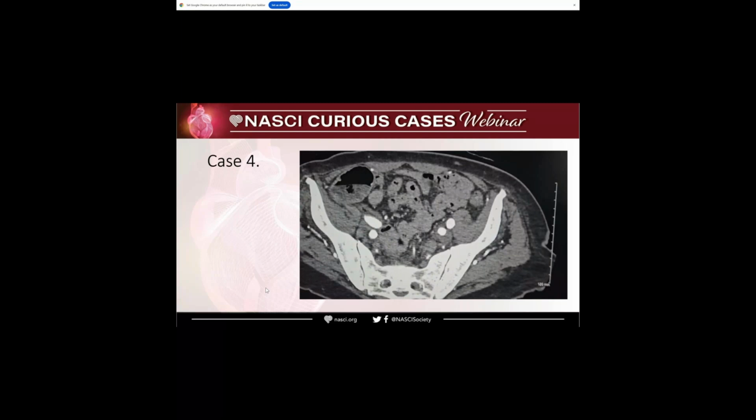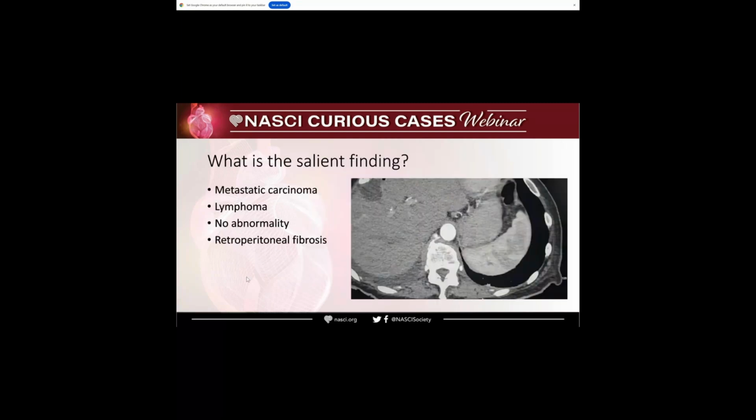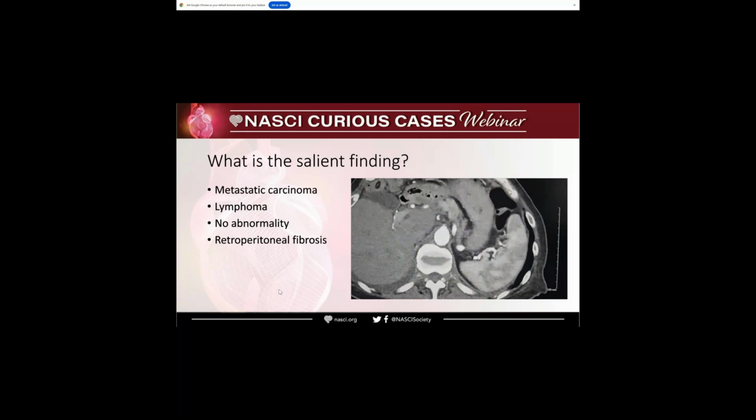What is the salient finding? I'm showing the video again so you can see it while you see the options.